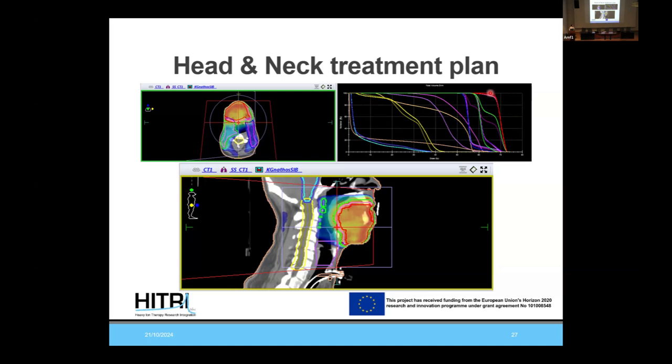So we are looking here. Here the PTV curve starts to fall. And we are trying to see whether the score is 100%, 95%, 97%. We will discuss later.